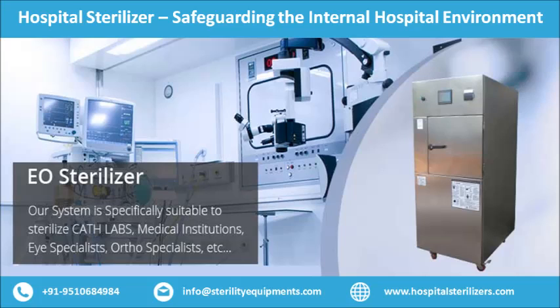Ethylene oxide sterilizer comprises a sterilizing chamber that has an air inlet containing a bacteria obstructive filter, a steam inlet, gas conditioner, an ethylene oxide gas cylinder and a vacuum system to release the gas from the chamber through a drain outlet. ETO sterilizer for hospitals is fitted with chambers that need to be heated up by electrical resistance or through the steam contained in a jacket surrounding this chamber.